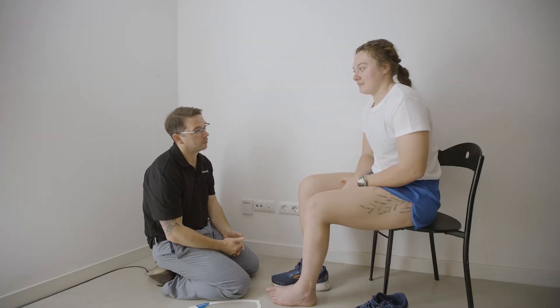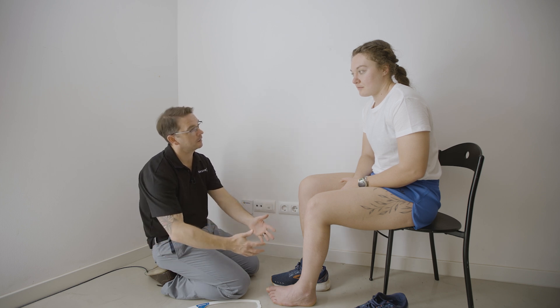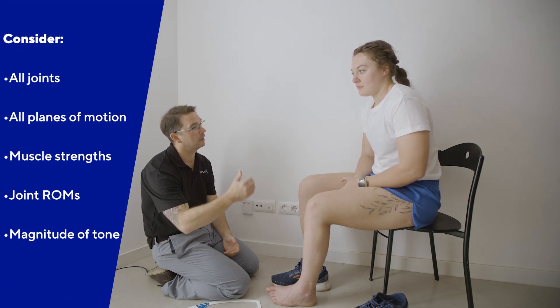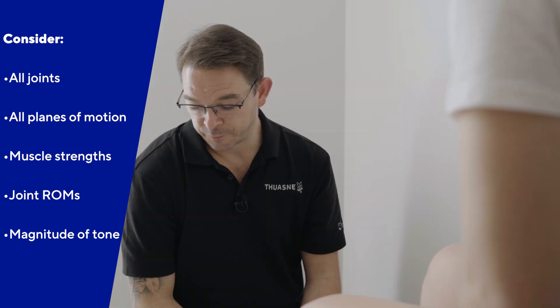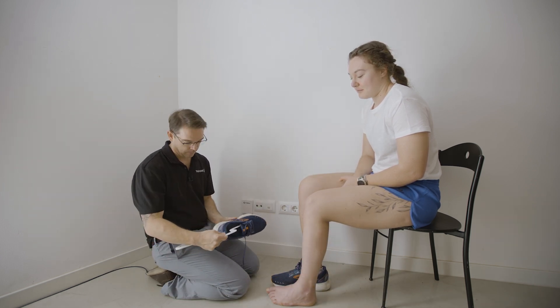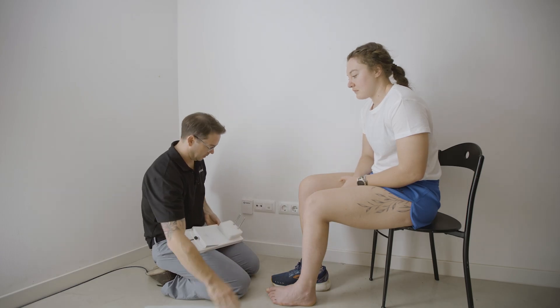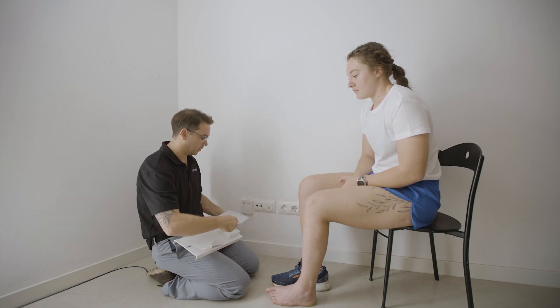I am going to assess you now for the casting of a Sprite Step Vector AFO. I am going to work my way through the form. That is going to need me to put hands on you and feel your range of motions in your ankle, your knee and your hip. I will ask you to perform various movements so that I can gauge your strength or weaknesses. First on the list is your shoe — is it okay if I measure your shoe? We have a 20mm heel height which I now need to record on my form, and then adjust this pitch board accordingly. That is the position I will cast you in.